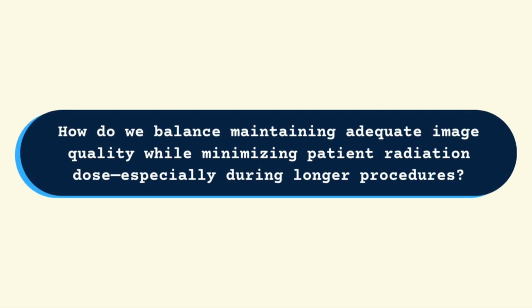All right, so the first question comes from Julie. She asks, since fluoroscopy provides real-time imaging using continuous or pulsed X-ray beams, how do we balance maintaining adequate image quality while minimizing patient radiation dose, especially during longer procedures? So I think my best advice for that is going to be to follow your doctor's orders. Your patients that are getting fluoroscopy exams or that are getting fluoro in the OR, they're just going to get more dose. That's just kind of the nature of the beast. But we want to make sure that we're not exposing unless the doctor has told us to. So that's going to be the biggest thing that's going to help minimize patient dose.